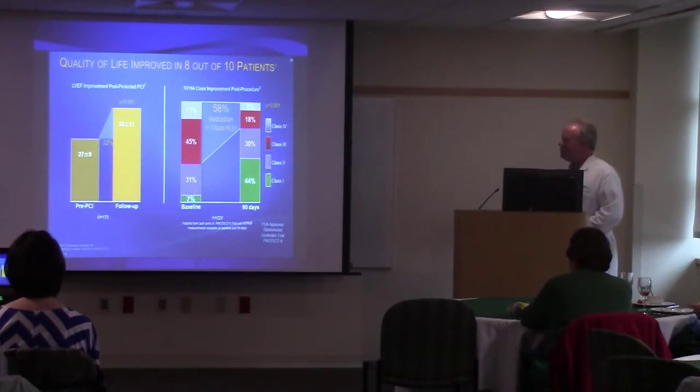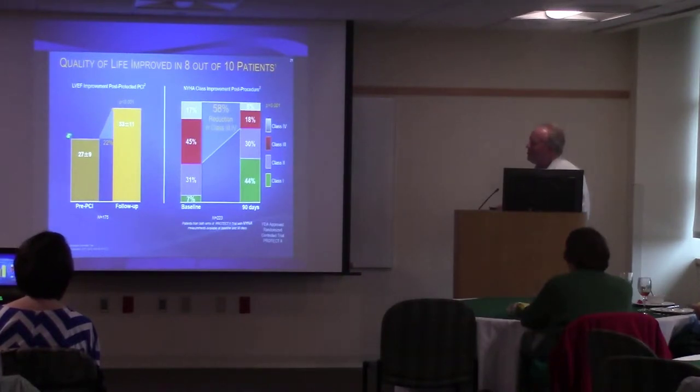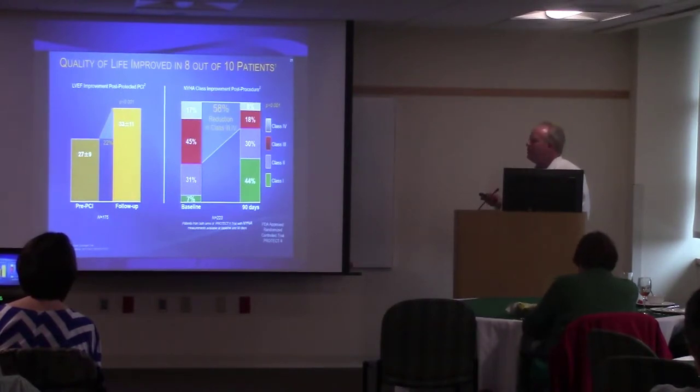This is my last slide, and I hope I'm not boring you too much, but this represents, again, after the procedure is performed, these are outcomes data. In general, we increase heart function by 22% after the procedure, after we revascularize the heart, open up the blockages. By using the pump for support, we can increase the heart function by 22% on average. And probably more importantly, patients feel better.